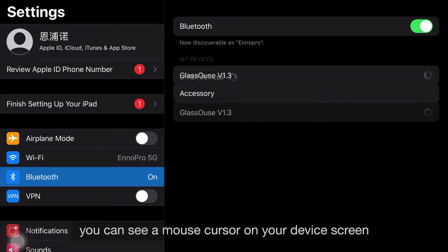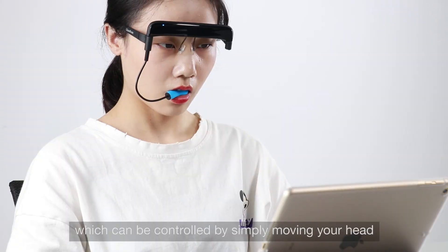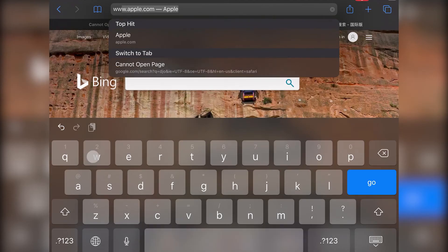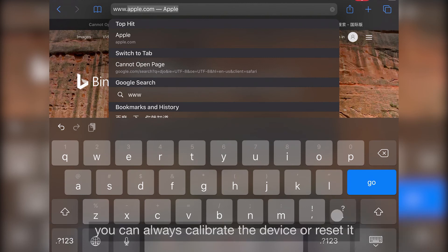After connection, you can see a mouse cursor on your device screen which can be controlled by simply moving your head. You can adjust the sensitivity and cursor speed either via the device or Glasshouse itself. If you find the cursor is not moving as per your head movement, you can always calibrate the device or reset it.